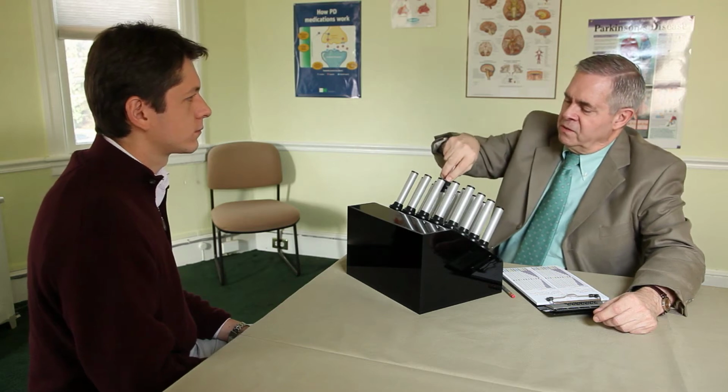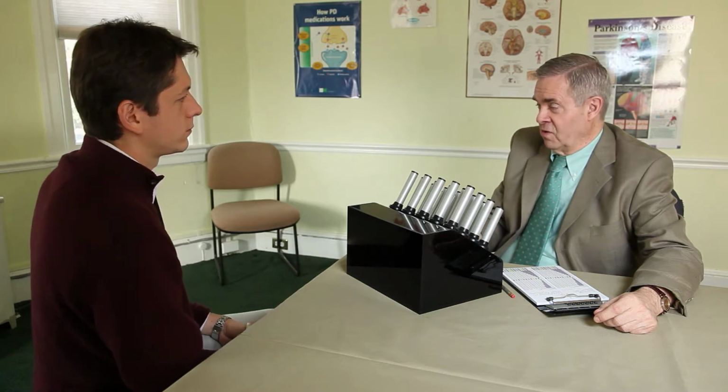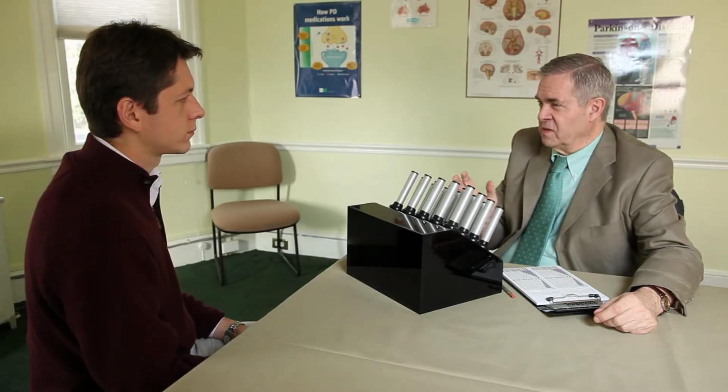What I'm going to be asking you to do is tell me which of the two that I present is stronger, the first or the second. If you're not sure, you have to guess. You have to tell me one or the other, okay? There may or may not be an odor per se. You may just notice something slightly different, and then you just report which is strongest, which is subtly different. It doesn't have to be a pure odor as we might think of an odor. Okay? That's understandable? Okay. So let's get started.